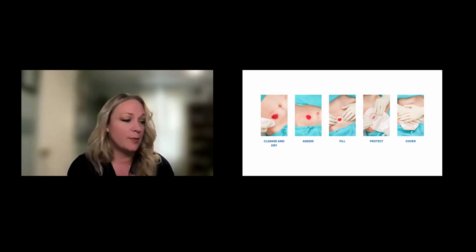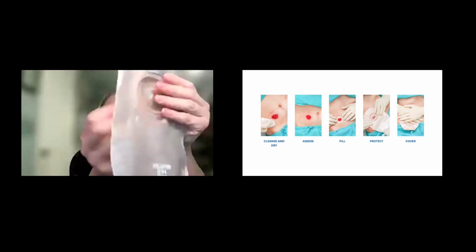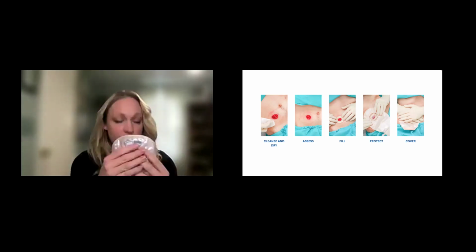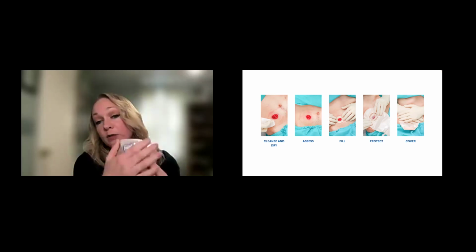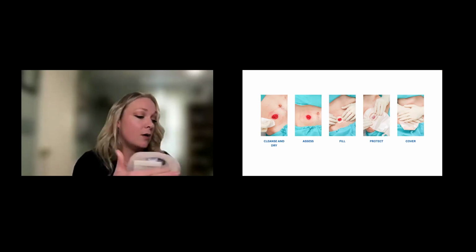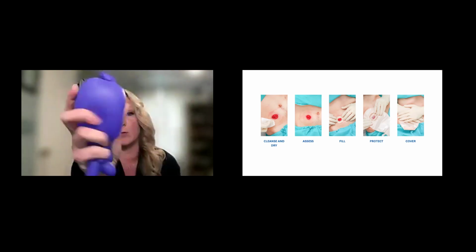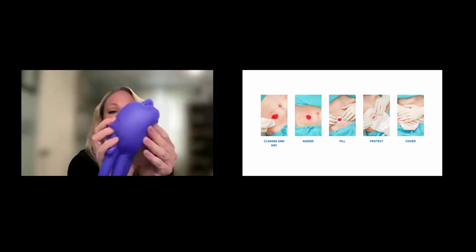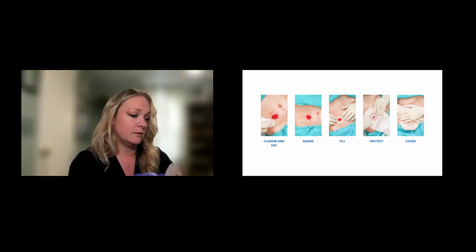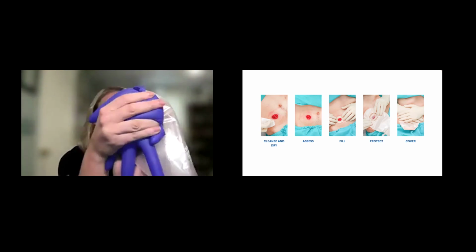Okay, we'll protect that and pick your matching appliance to go up with it. And then we're going to cover it and hold it. You want to make sure to apply some sort of heat, either by holding it with your hand, having your patient lay flat and splint if it's a difficult one, or you can also just fill a normal glove with some hot water, not too hot. You don't want to burn your patient. Then you can place that up against the appliance on their stomach and help that hydrocolloid adhere.